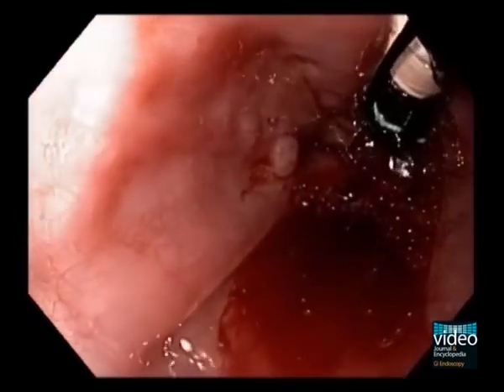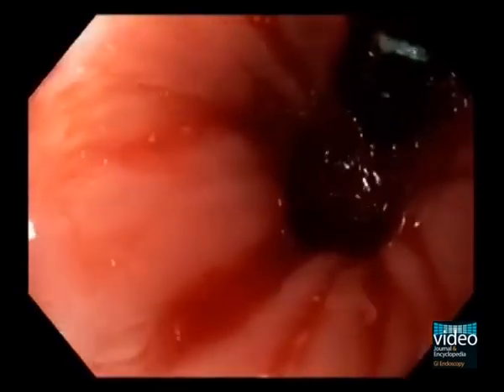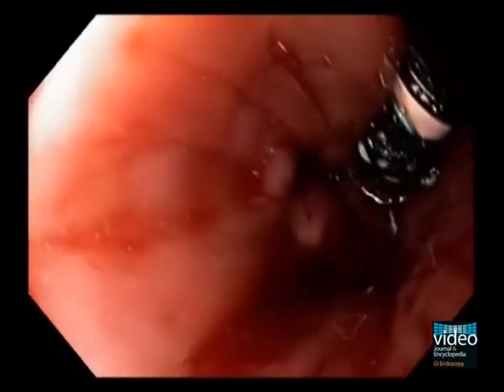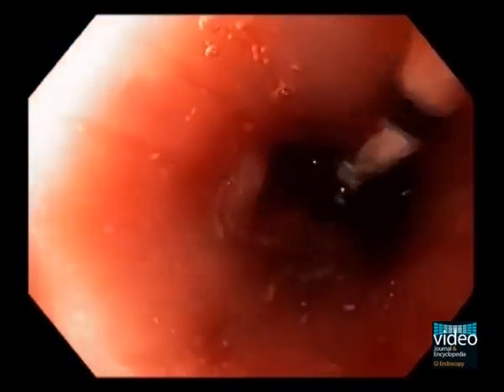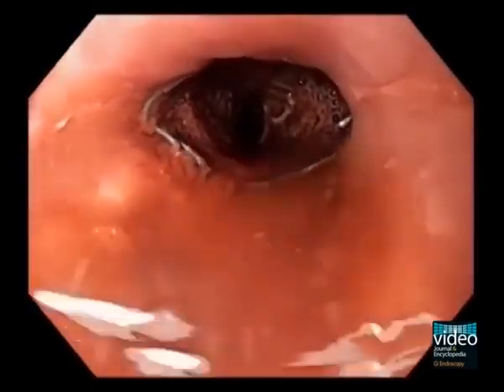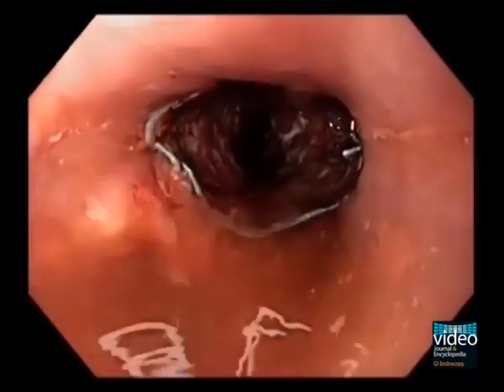The stent is then advanced over the wire and deployed. Because the tumour is very proximal in this patient, an effort is made to overlap the proximal end of the stent to the very proximal end of the tumour as much as possible. After stent deployment, the delivery catheter and associated guide wire can be removed from the patient. The stent can then be inspected for position, patency, and signs of any immediate complications.